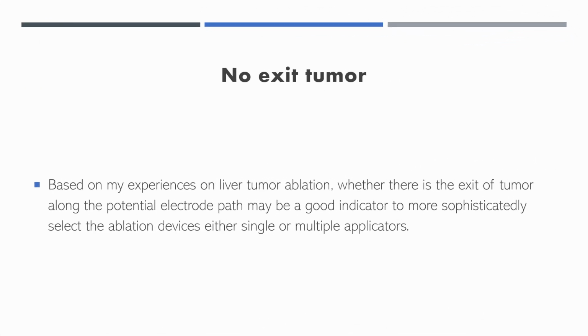Based on my experience on liver tumor ablation, whether there is the exit of tumor along the potential electrode path may be a good indicator to more sophisticatedly select the ablation devices, either single or multiple applicators.